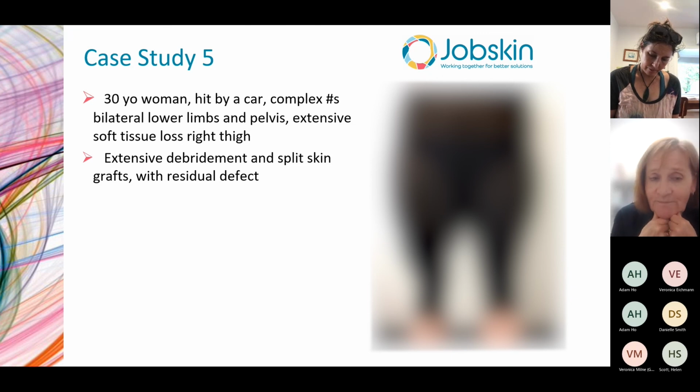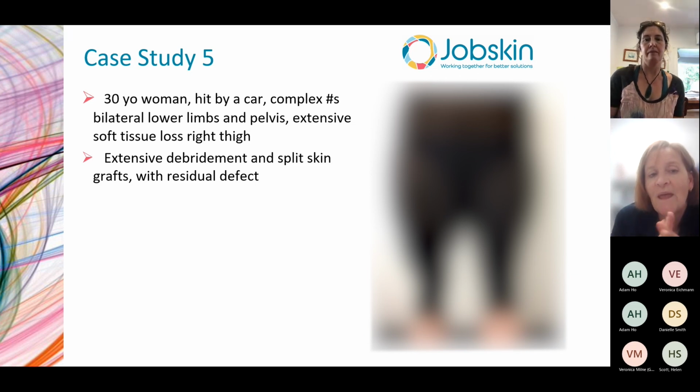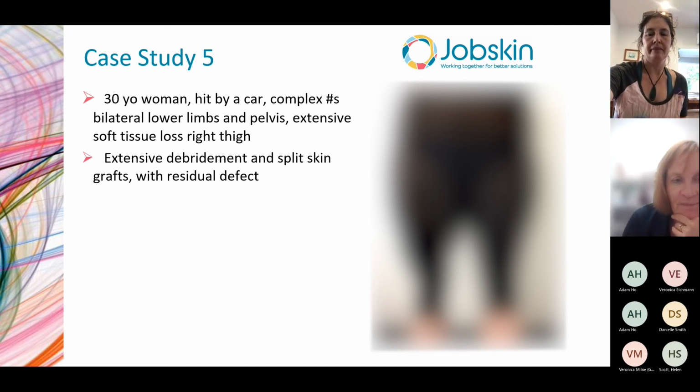But there is the risk that you can get pressure breakdown right on the borders of the defect because they're getting extreme pressure there. And also you're not achieving anywhere near what you could or want to be achieving. So that memory foam defect basically makes it all work together.